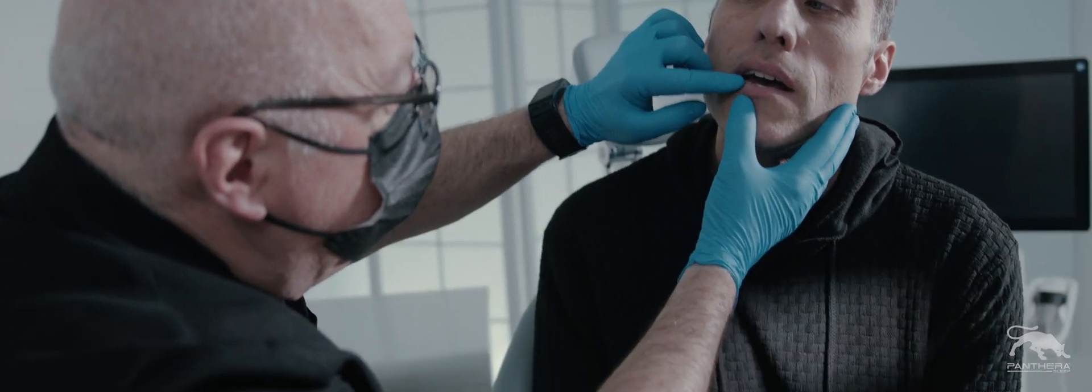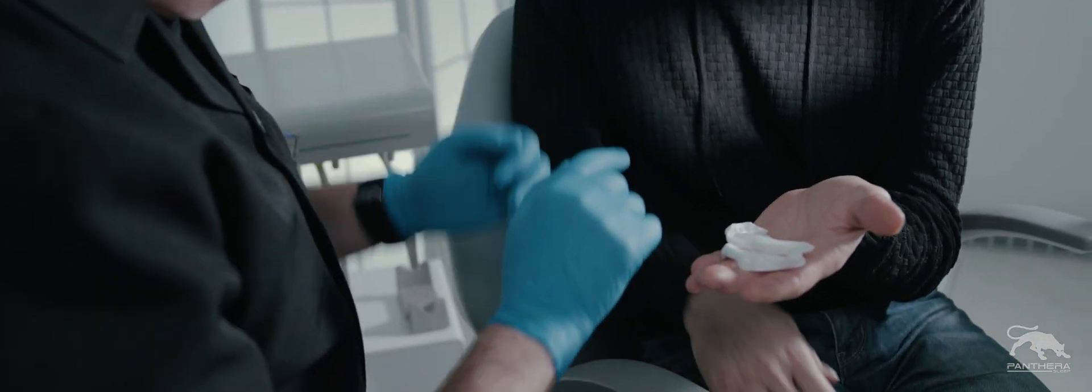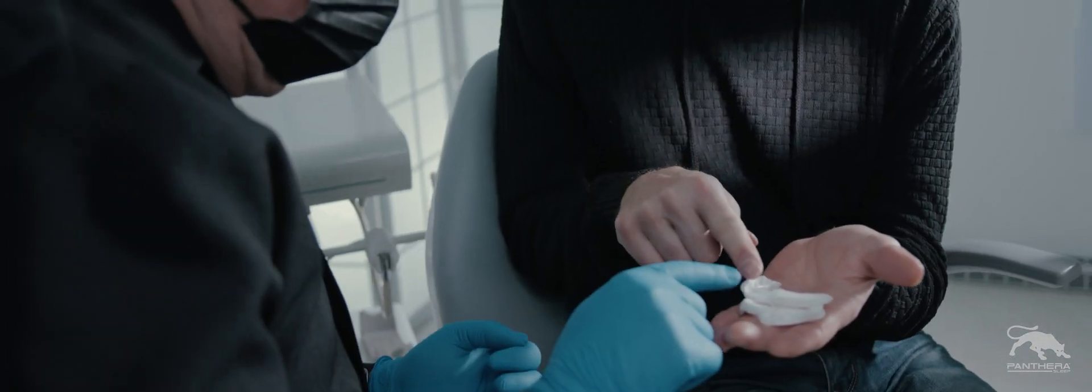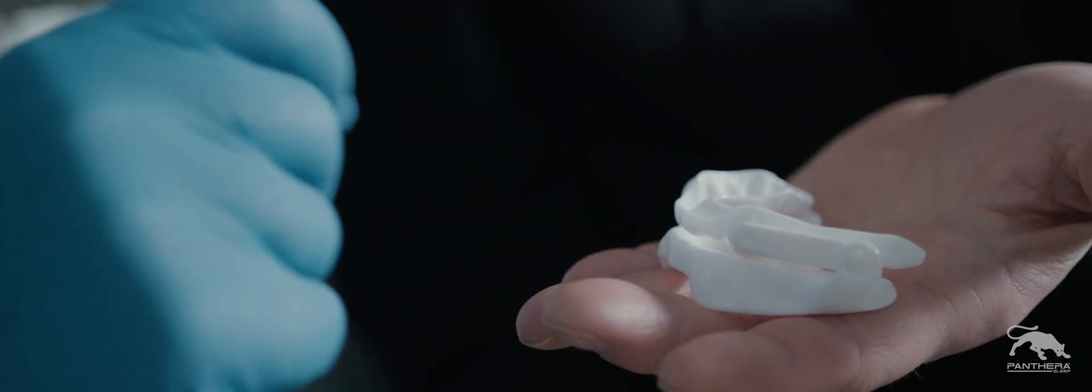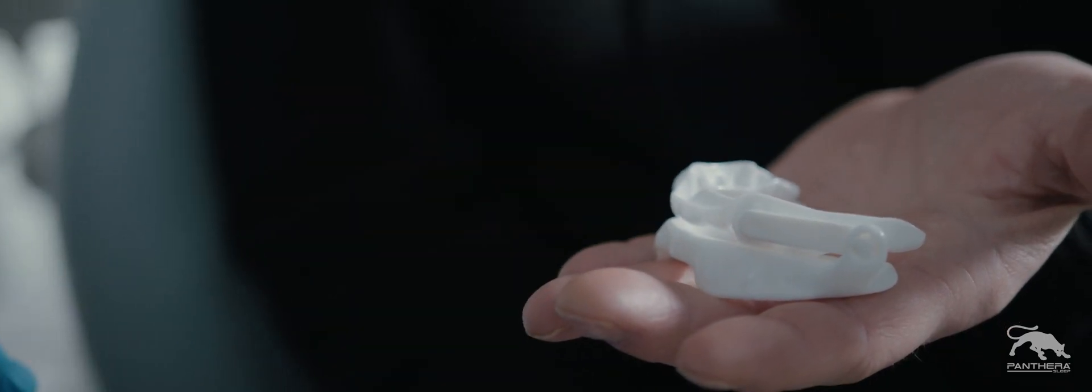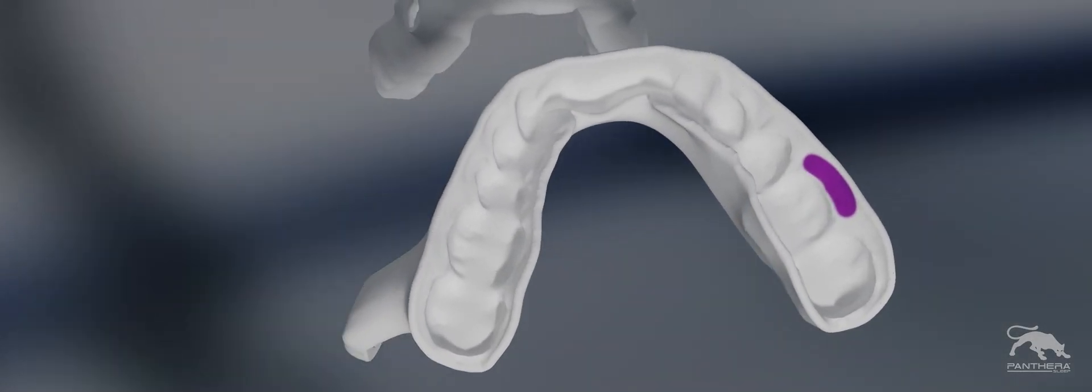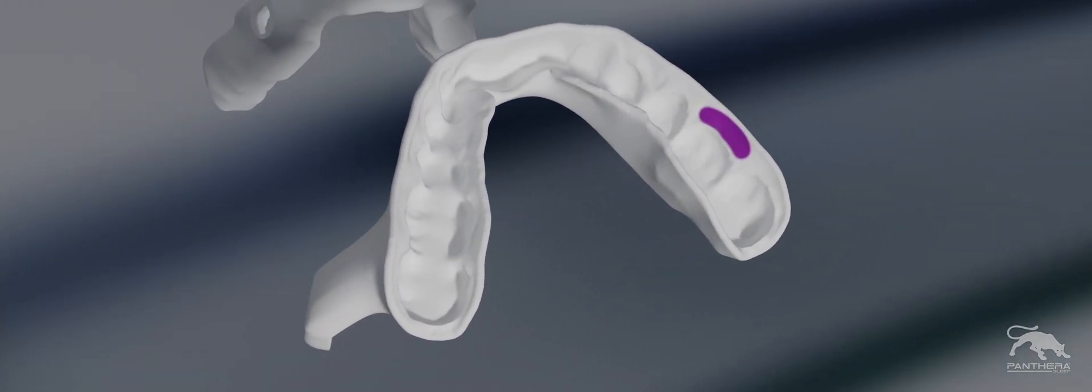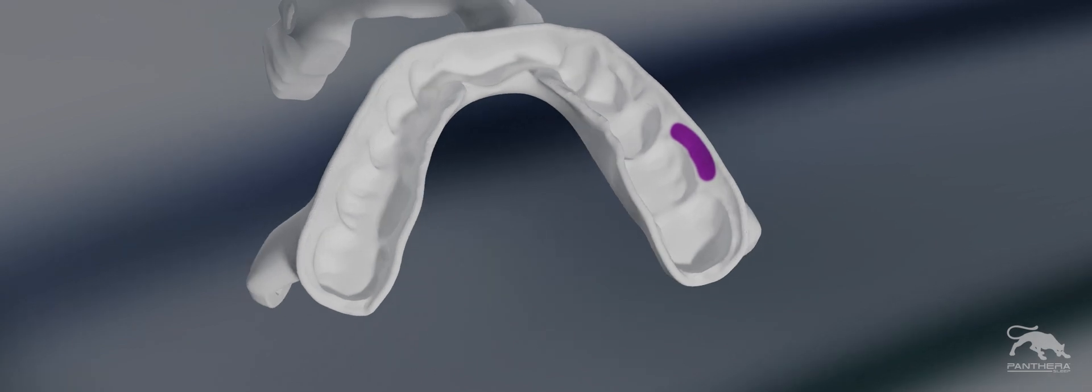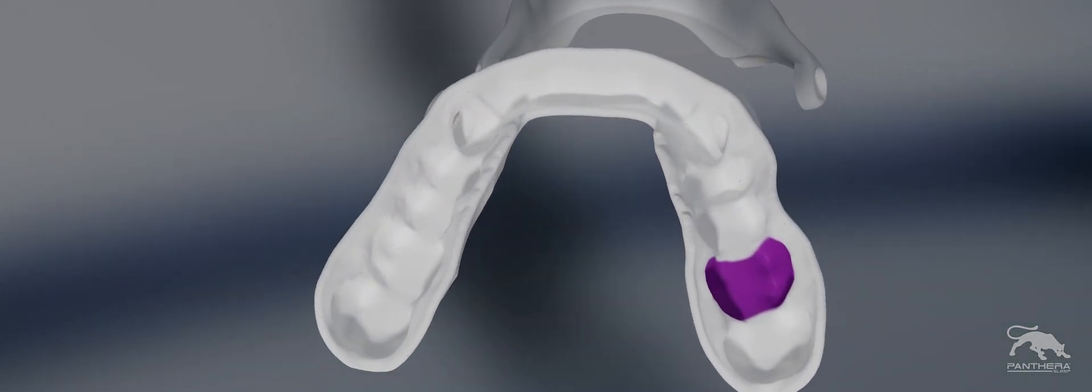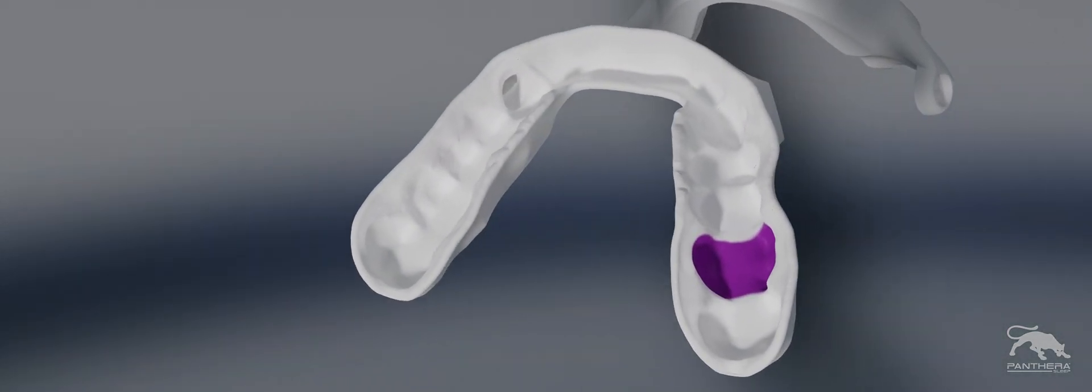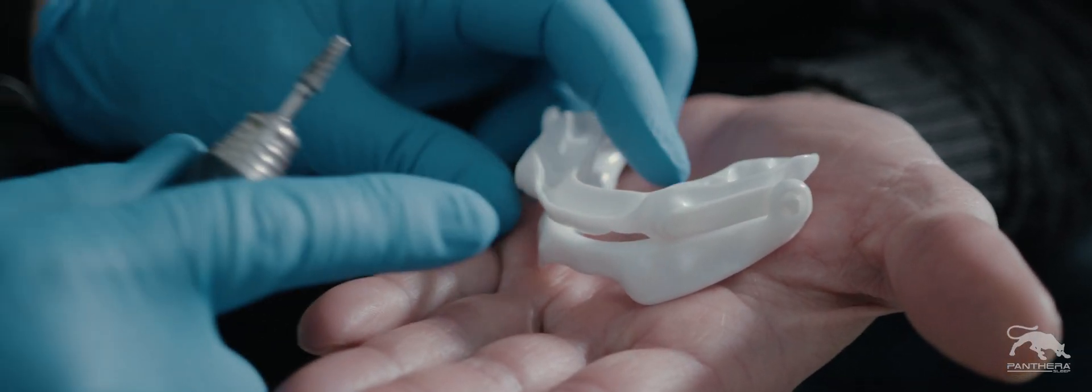Referring to the patient's reports of discomfort, locate the area on the oral appliance that needs to be modified. For example, the lower or inner curve of the arch of a splint in the case of soft tissue irritation, or the appliance being too tight causing discomfort to a tooth.